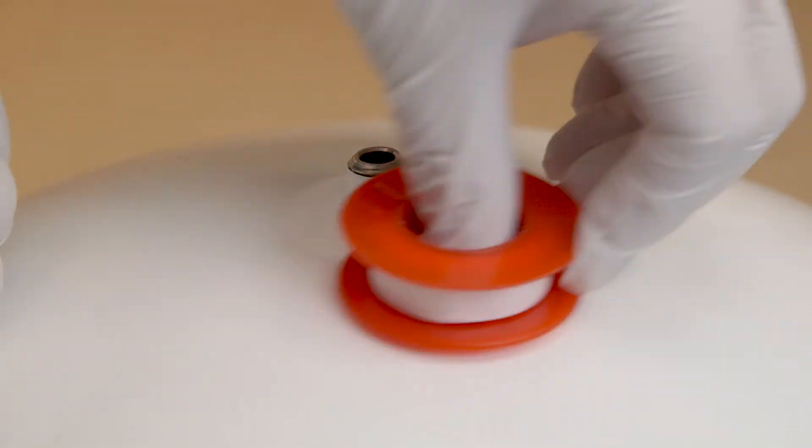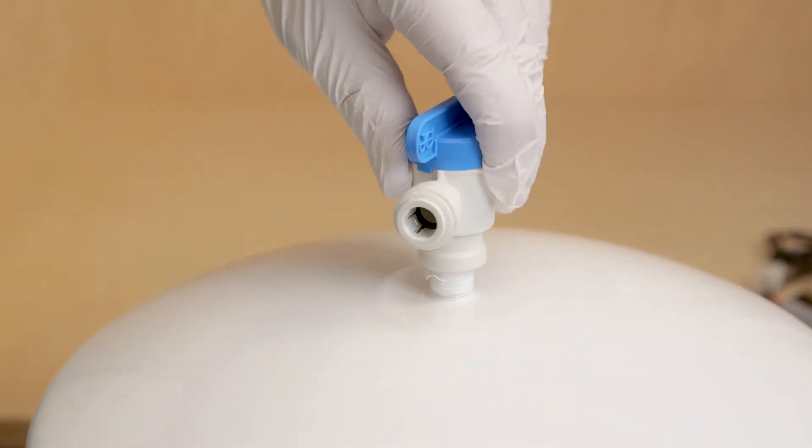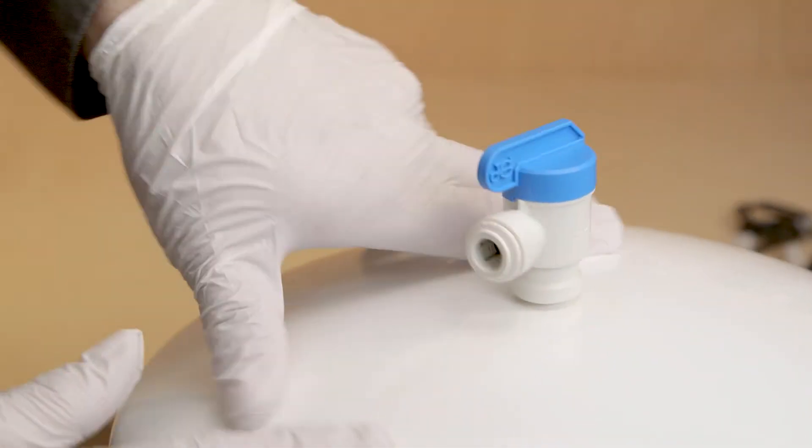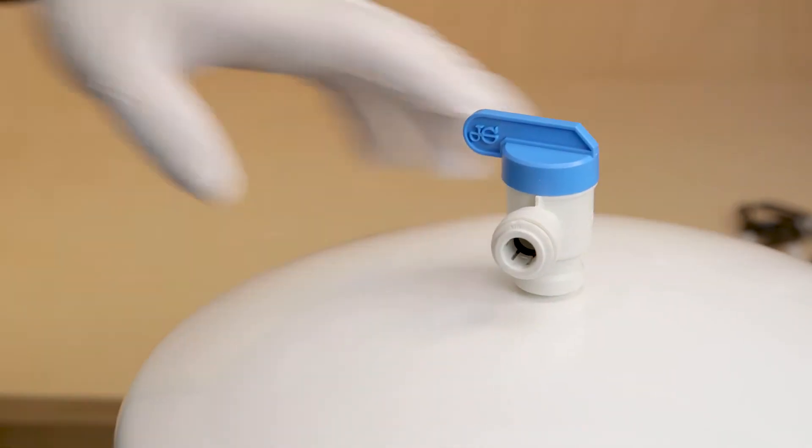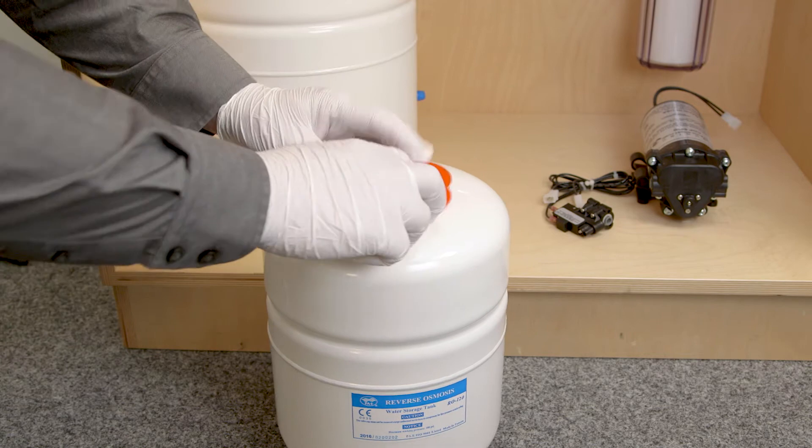Using thread tape, wrap the threads on each bladder tank. Take the three-eighths inch valve and hand tighten it to the larger RO tank. Do not over tighten this valve. Turn the blue valve 90 degrees to close it. Repeat this process with the one-quarter inch valve for the dental water tank.